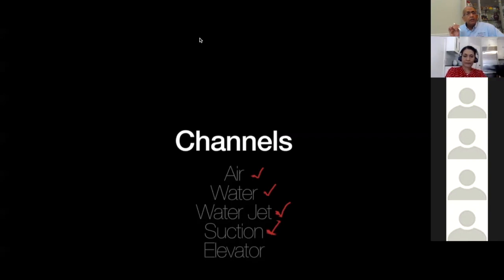And then when you come to ERCP scope or a therapeutic EUS scope, there is another function, the elevator with its own channel. And that elevator channel has made a lot of problems, has been responsible for the majority of the CRE infections that we encountered.